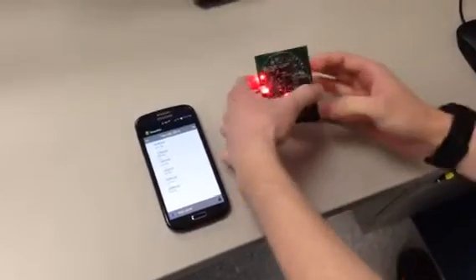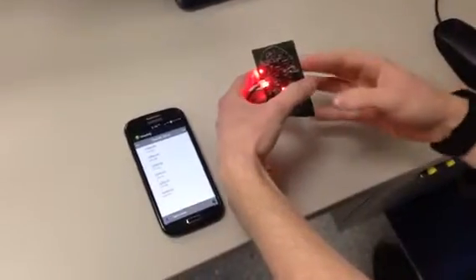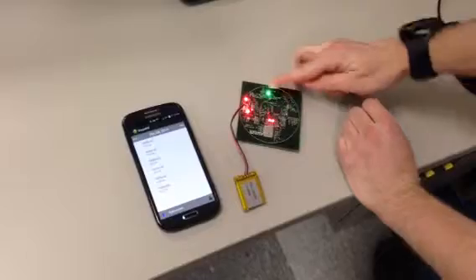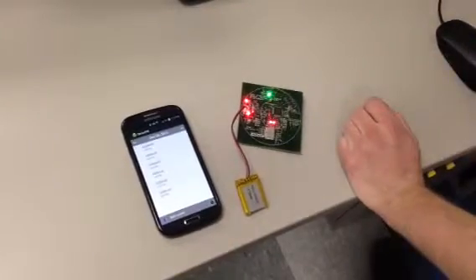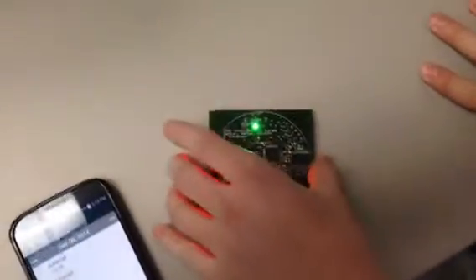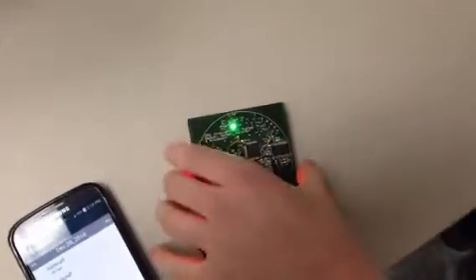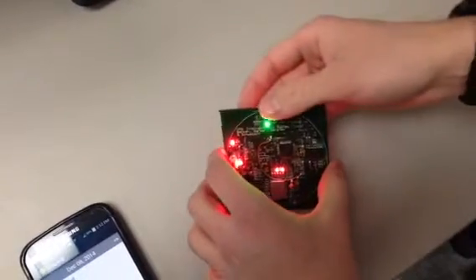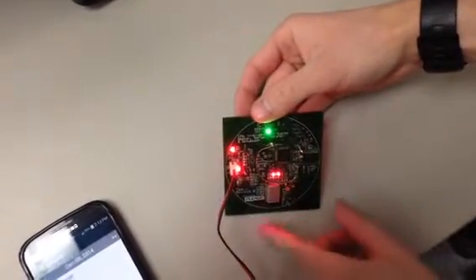So really quick, I'm just going to simulate a notification that says they need to take their pill. When it's actually time, this green light is going to light up and shine through the pill bottle enclosure and tell them that they have to take their meds. When that happens, we're just going to simulate it with a button press, but essentially the patient would take their medication, and this system would actually know it.